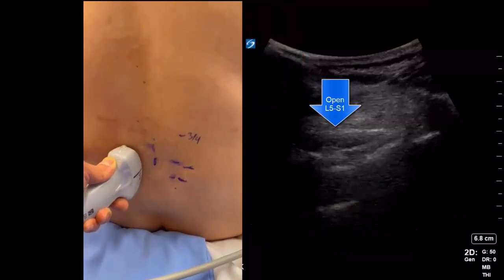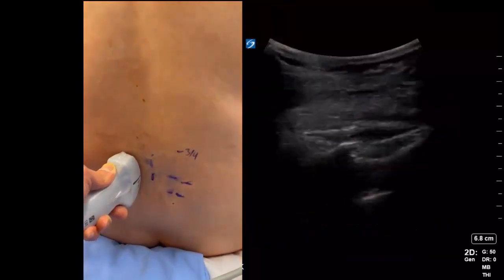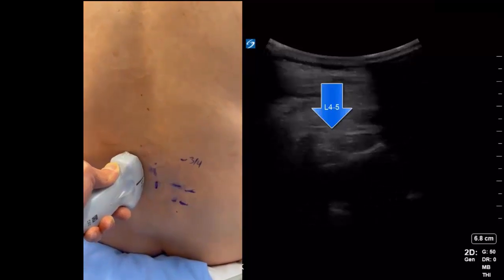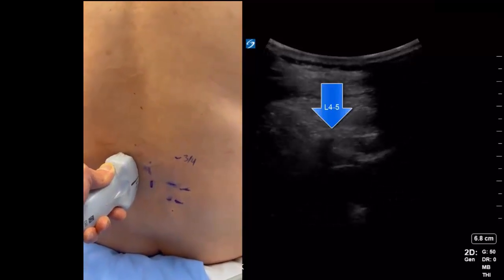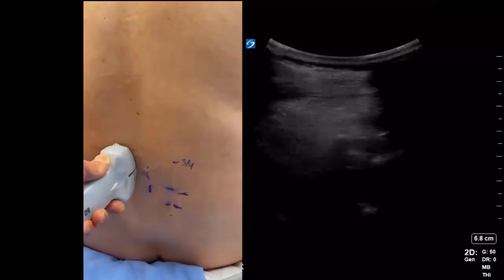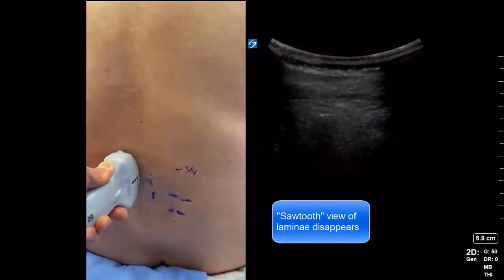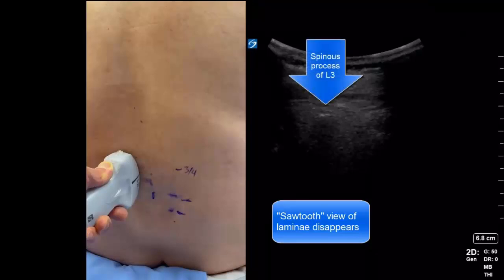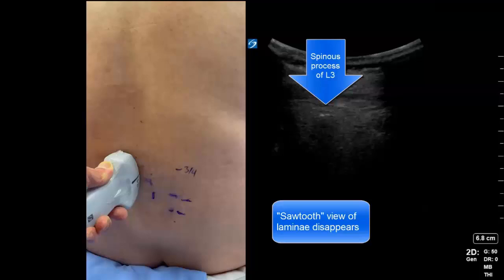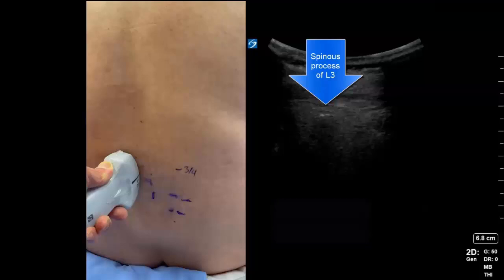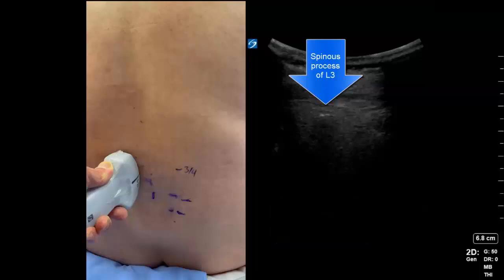Sliding the probe cranially, we see a narrower L4-5 space, but then something peculiar happens. The sawtooth view of the lamina disappears, and we instead see a tall dropout shadow, which is the spinous process, in this case of L3.